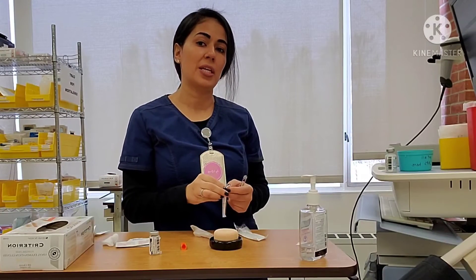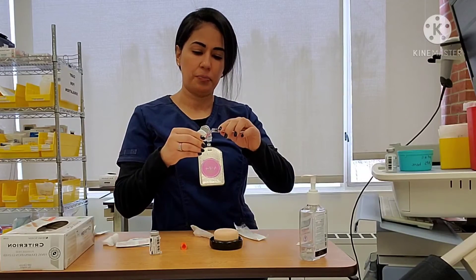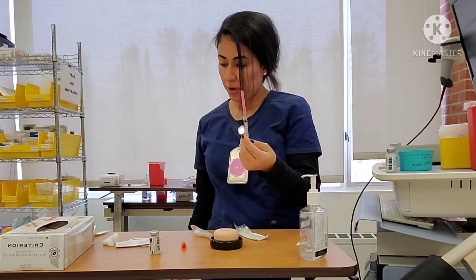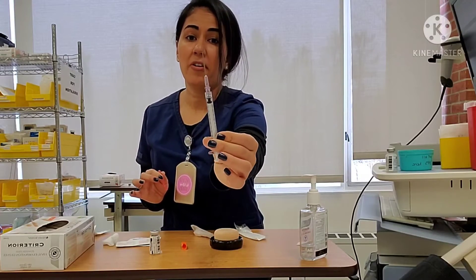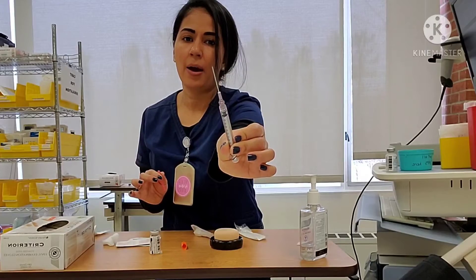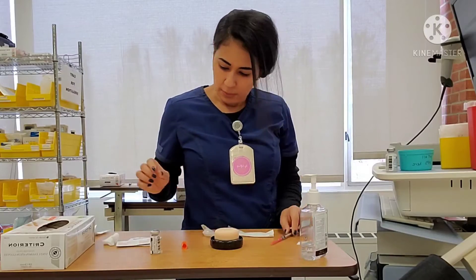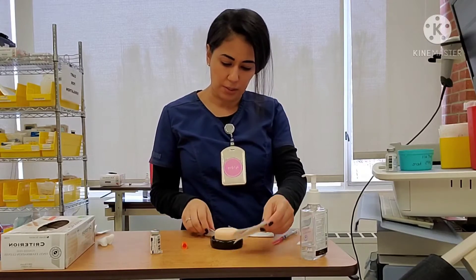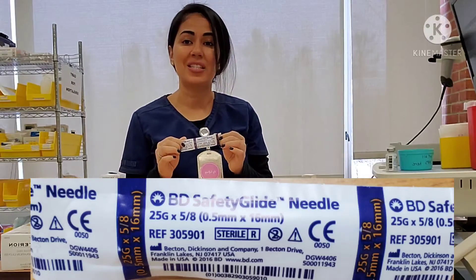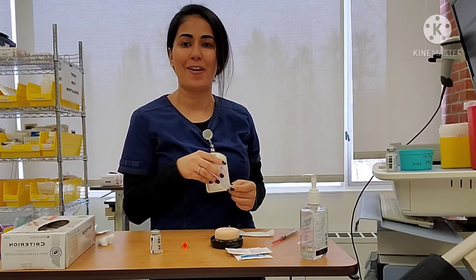With the insulin syringe, we used the needle that already came with it. With heparin, heparin can be irritating to the surrounding tissue, so I'm going to want to use a blunt needle. A blunt needle is appropriate for withdrawing medications or specimens, but not for injecting into the patient — look how big this is, it's very thick and it's not meant to pierce the skin. I'll also need two alcohol swabs, one for the vial and one for the patient, a gauze, and my subcutaneous needle — in this case a 5/8 inch, 25 gauge needle.